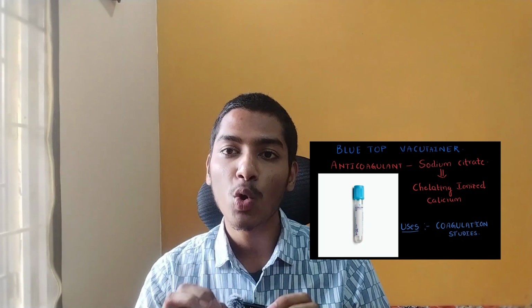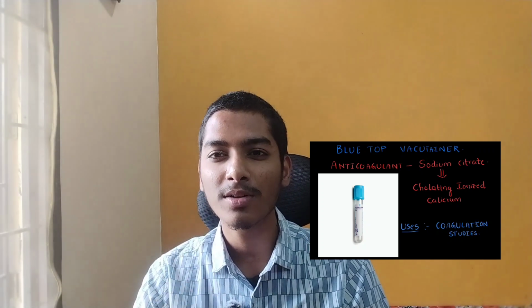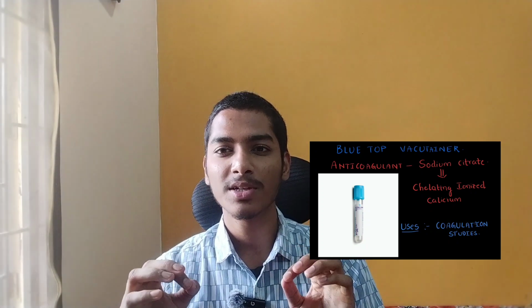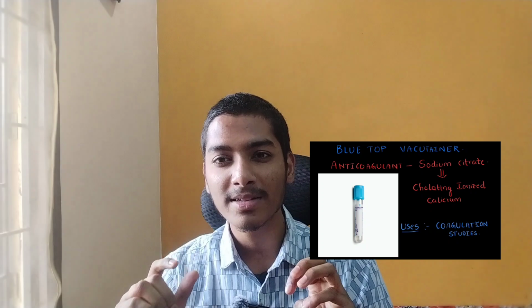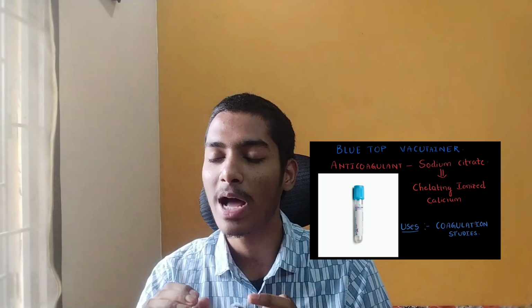Next we have the blue top vacutainer. The anticoagulant present in the blue top vacutainer is sodium citrate. How it acts: it chelates the calcium ion, right? You all know that we have the intrinsic pathway and extrinsic pathway in coagulation. So the calcium ion plays an important role in the coagulation cascade. By chelating this calcium ion, the sodium citrate inhibits coagulation.